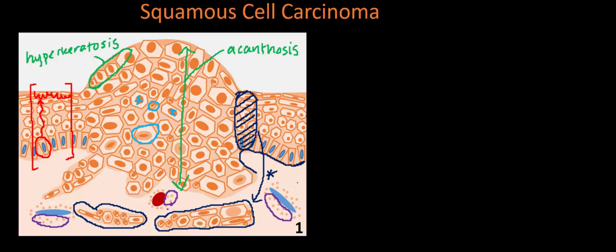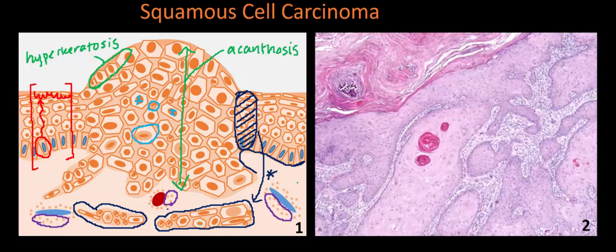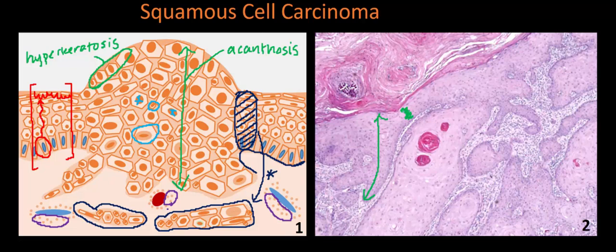Now let's look at an actual H&E stain of a squamous cell carcinoma. At the top in the dark pink stain is the stratum corneum, which mostly consists of keratin and is the uppermost epidermal layer. Directly below it in lighter purple is the remainder of the epidermis. Notice there is wide variation in the overall thickness of the epidermis — areas of acanthosis showing diffuse hyperplasia. Normally the epidermis would be much thinner, but here we see clear acanthosis.